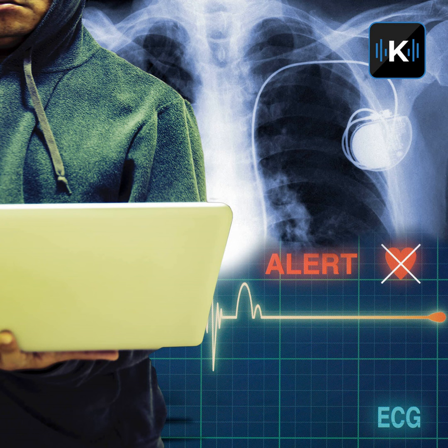So what's your advice for someone who's been told that they have to wear a connected device? I mean, they'll die without it. The advice really is to be aware that there is a risk from a cybersecurity perspective, and there's a possibility that an attacker could compromise the device. The probability is relatively low, though, and what needs to be considered is what is the risk of not having the implantable device? Typically, the risk of not using a device such as a pacemaker far outweighs the risk of a potential cybersecurity attack.